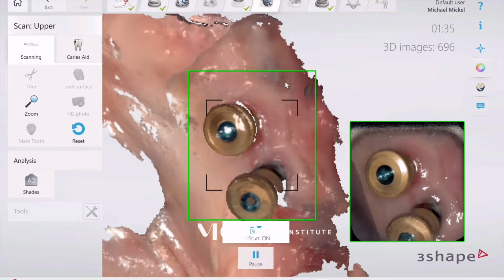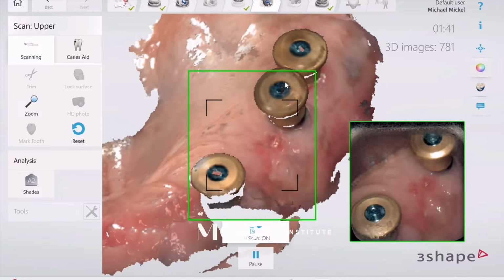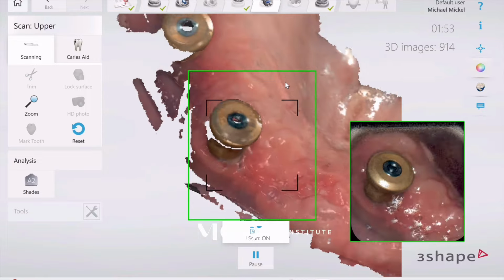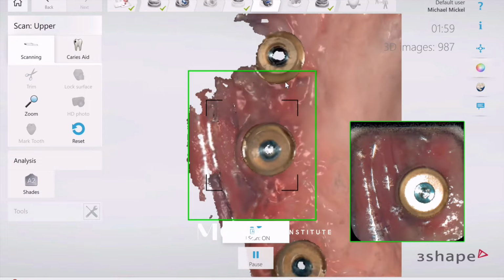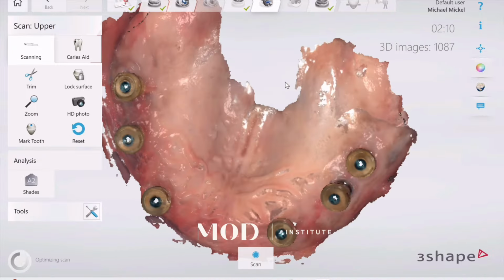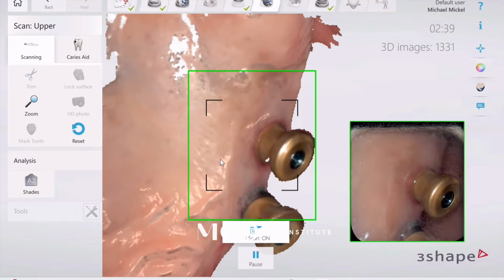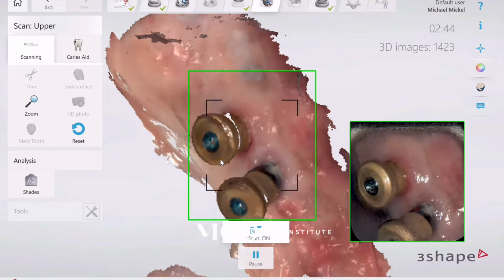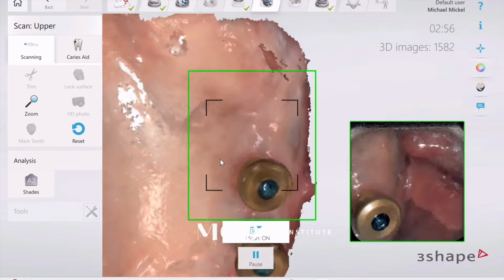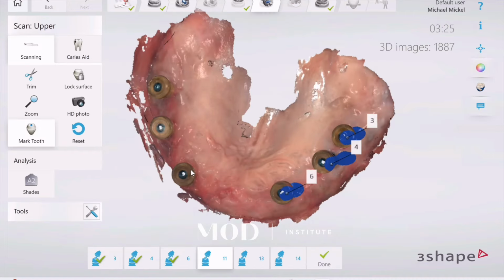This is a mushroom style that's a little bit undercut, and I think I prefer the dome shape style, which is easier to scan. Sometimes with these mushroom scan caps, the AI delete automatically removes them. And of course, you could turn that off in 3Shape, but it's sometimes just easier to scan it and have it connected to the tissue like that so it doesn't delete them. They have a dome style that is easier to do.